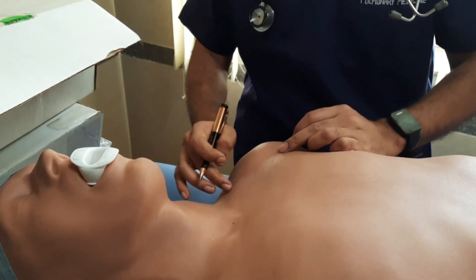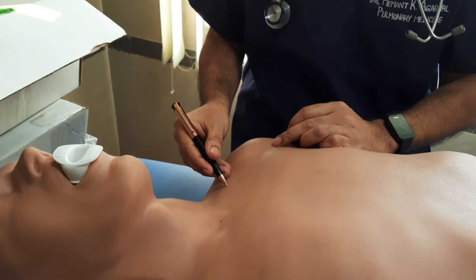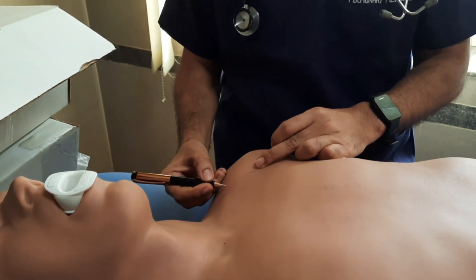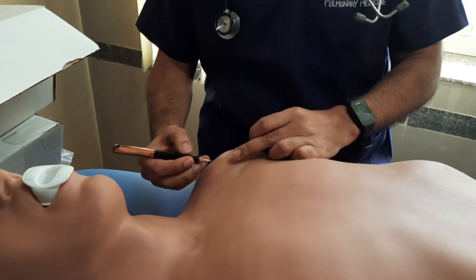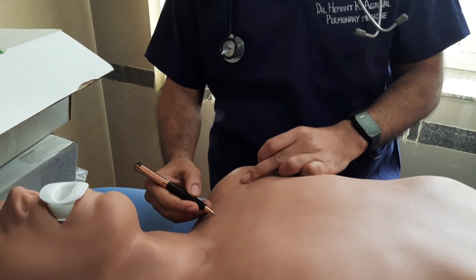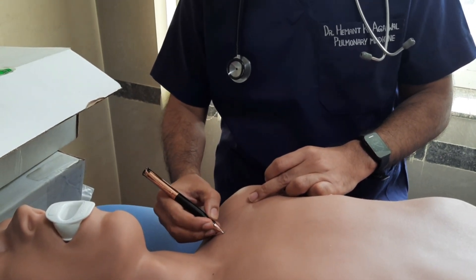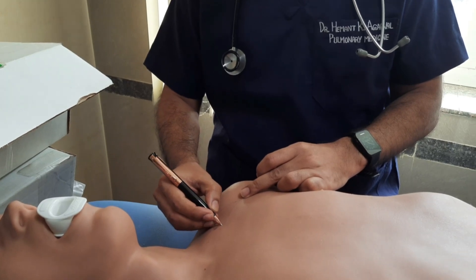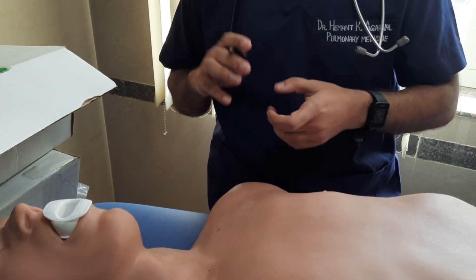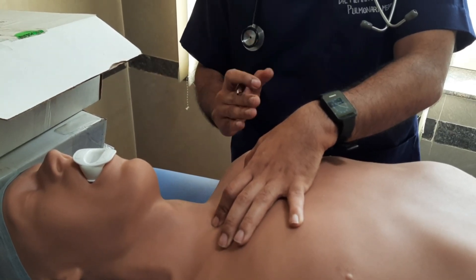There is another method using an imaginary triangle. The lateral border of the triangle is made by the deltoid, the medial border by the pectoralis major, and the base is the clavicle. Take a point on the apex of the triangle, and one centimeter below this point is our central line insertion site.